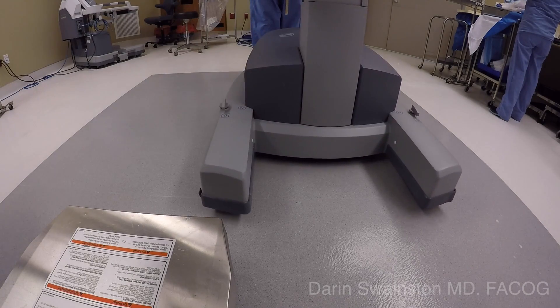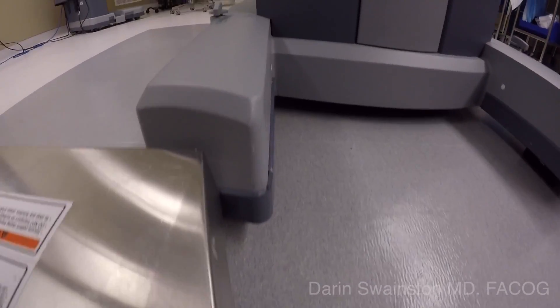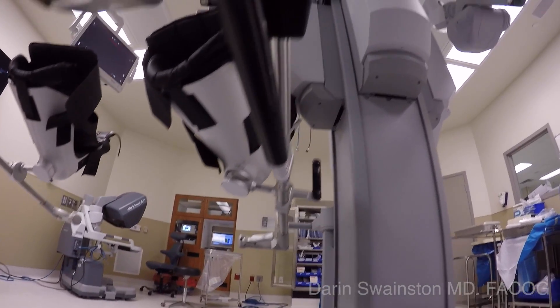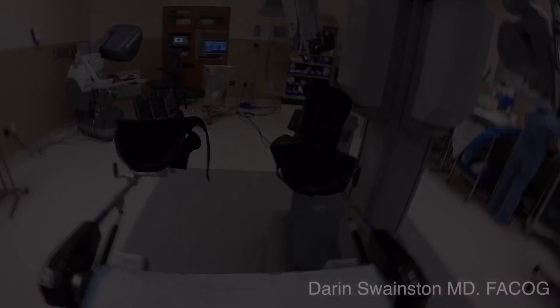The cart is brought in parallel with the foot of the bed, and in this particular case it lines up perfectly with the outside. The drawback is the right leg has to remain slightly straight while the left leg can be brought out. This does not appear to be much of a problem, and the technique is well liked by the OR staff.